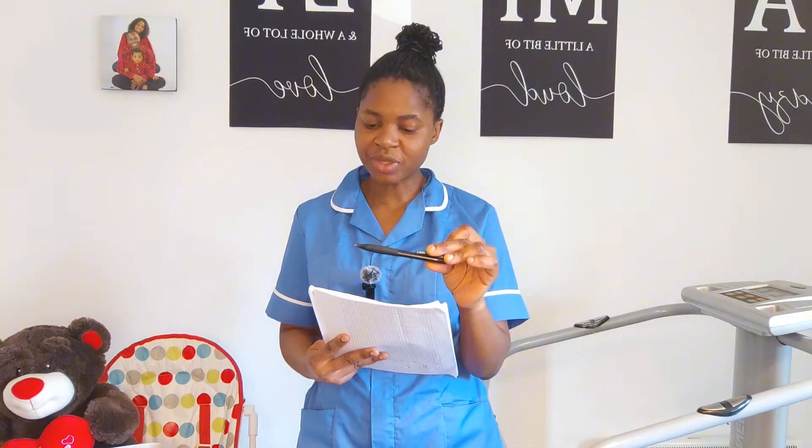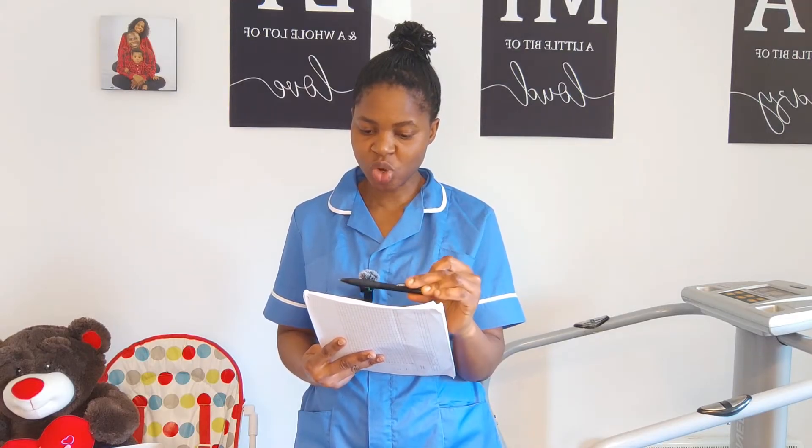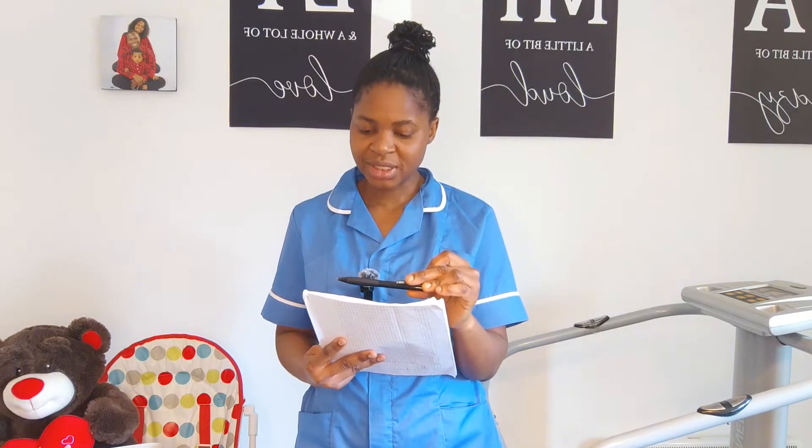I go ahead and validate the medication against my prescription to make sure it matches — I have insulin glargine, the same as what I'm holding, as per prescription. The dose is 14 international units, which tallies. I'm happy to proceed. Prior to every medication administration, the six rights must be ensured: right patient, right medication, right dosage, right route, right time and date, and proper documentation after administration. I have all six rights intact.